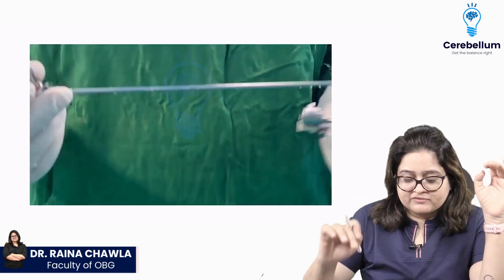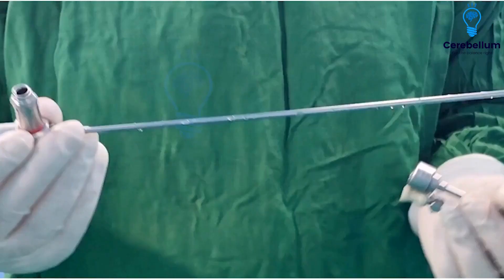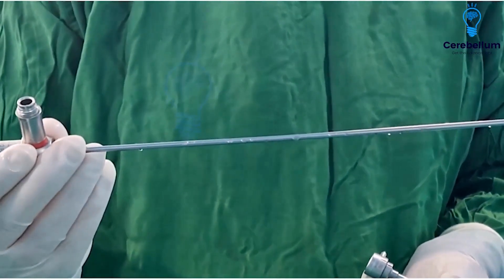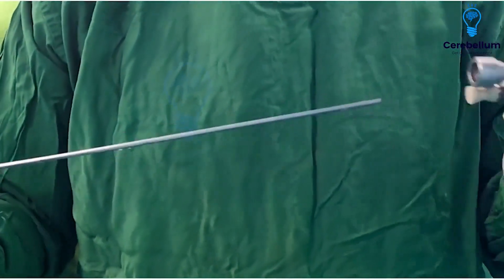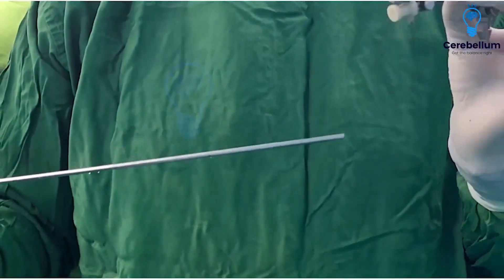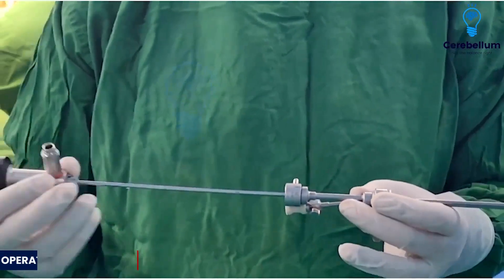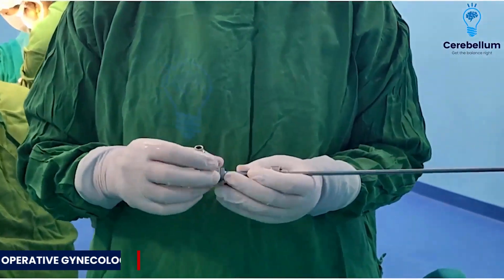So let's see the video. That's the scope in my hand, and in the other hand I'm holding the sheath. So I'm introducing the scope inside the sheath. This is an operative hysteroscope which I am assembling.